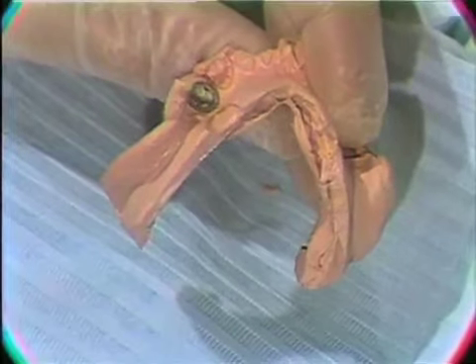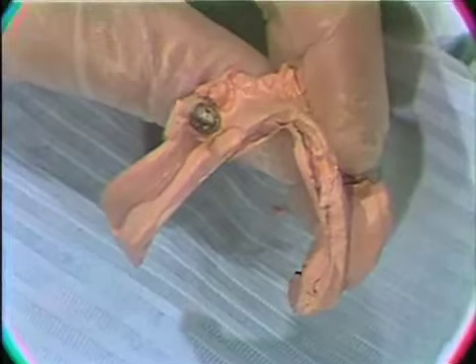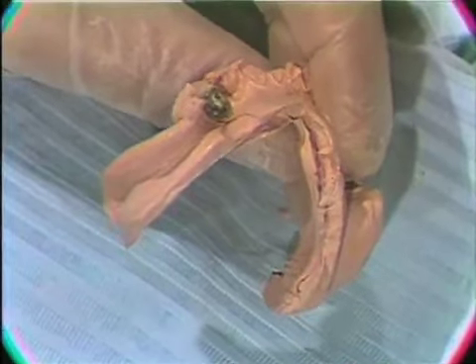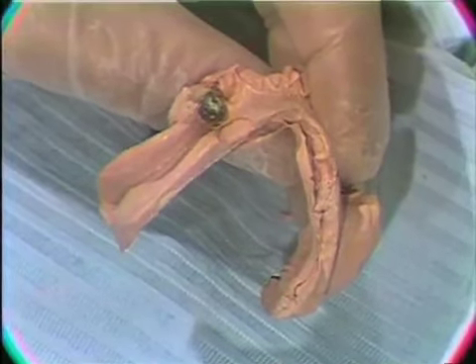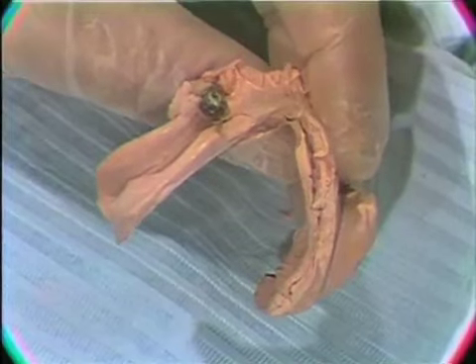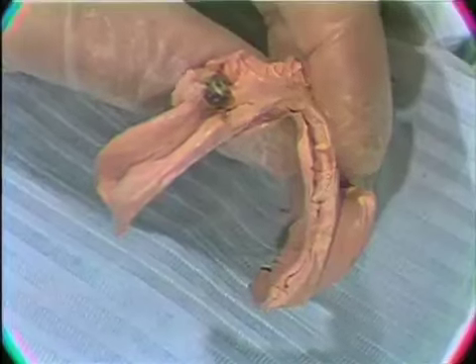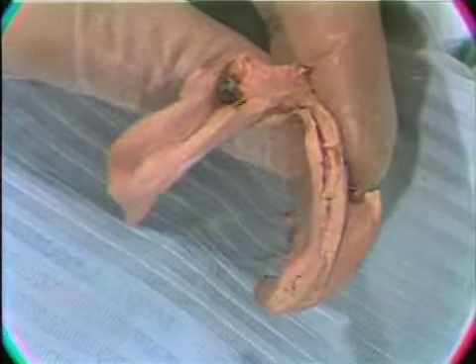We will not attempt to wash this impression to secure a new impression, but we will tear out all of the impression material and retake the impression again after we've trimmed the tray. If you try to wash the impression, we would have a very close-fitting tray and a thin fluid in there. We would distort the tissue in trying to force the material out of the tray. So we'll now go back to the lab and trim our tray.